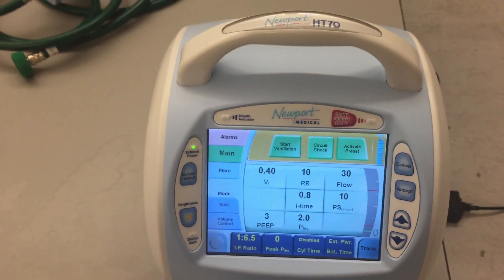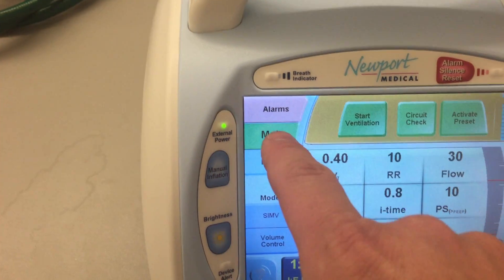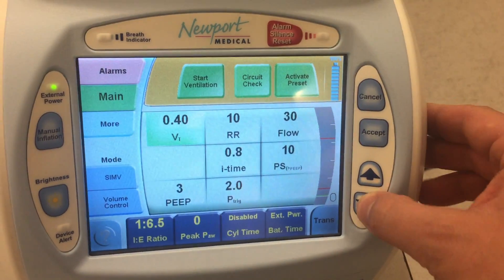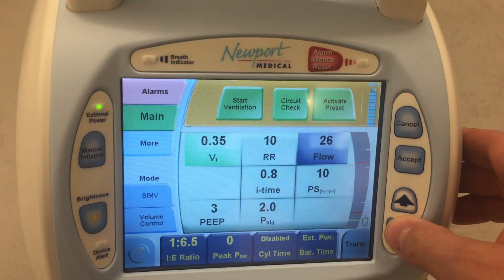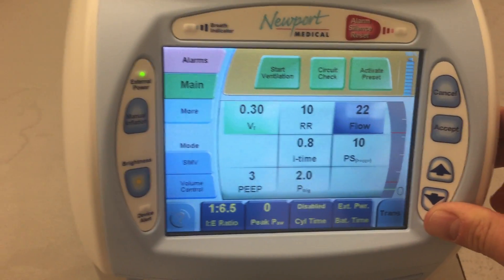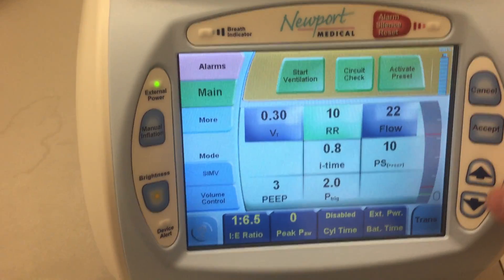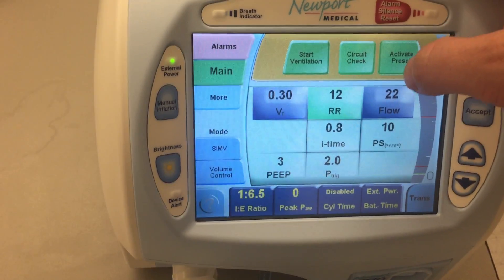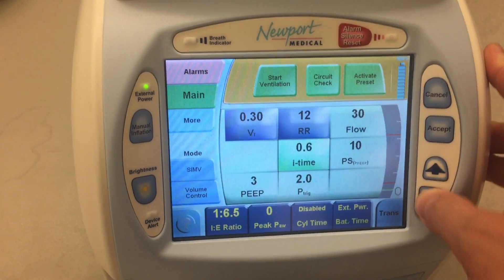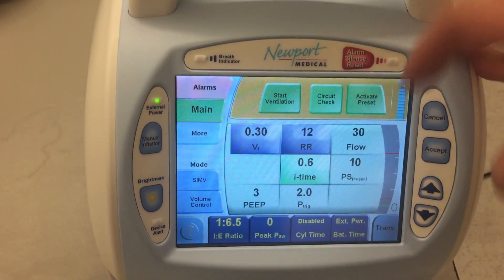So now I want to put my individual settings in. Let's say that we want a tidal volume of 300 milliliters. I'll select tidal volume, and then with these arrows I will go down to 300, or 0.3 liters. Let's say that I want a respiratory rate of 12, so I'll go here and put this up to 12. Let's say that I want an I-time of 0.6 seconds — and you see that it automatically adjusts the flow.